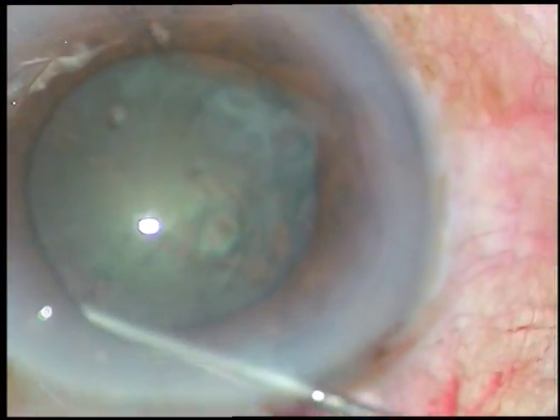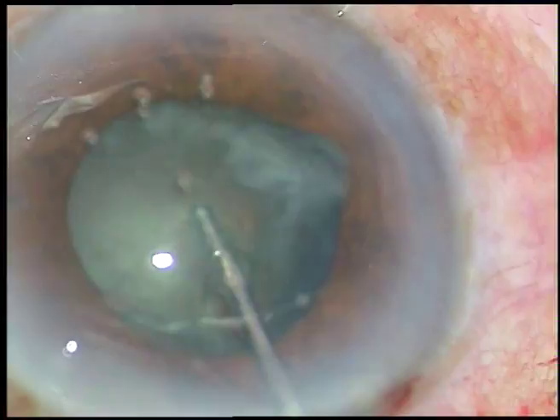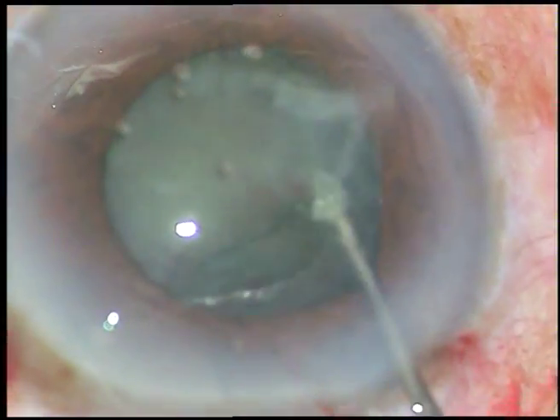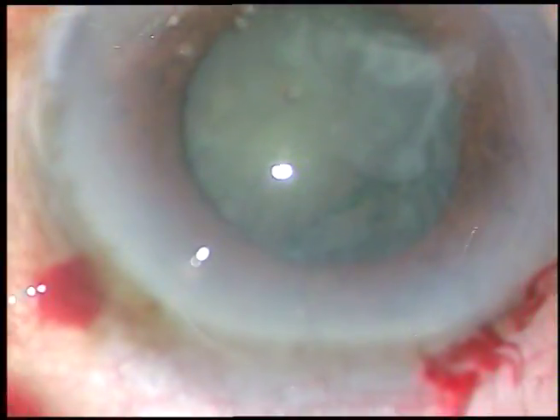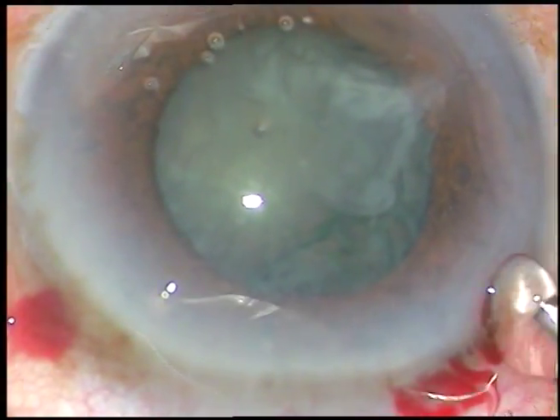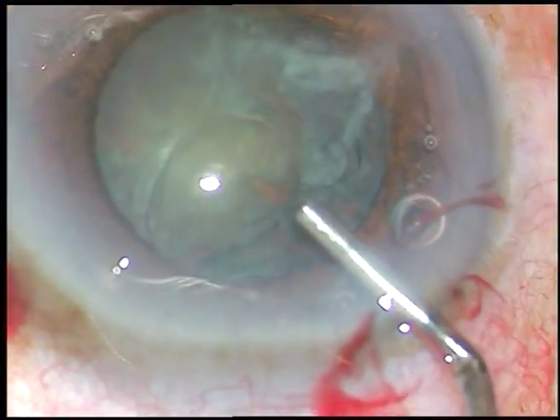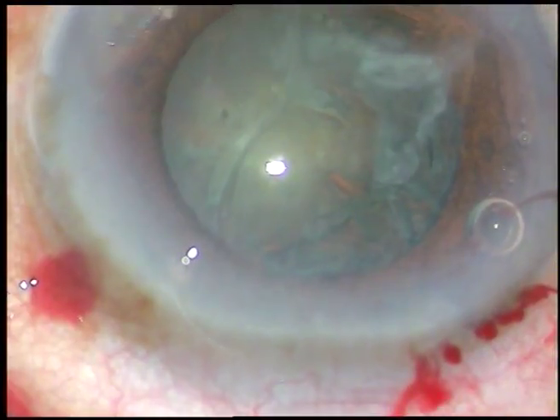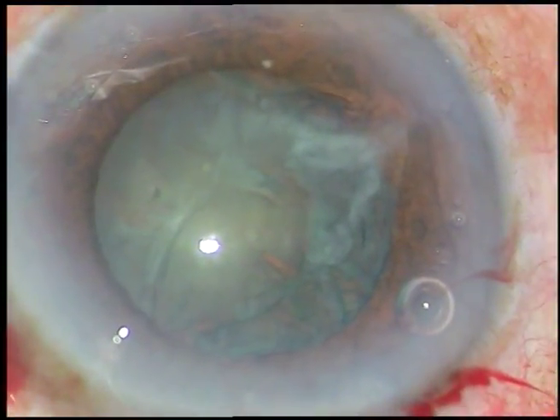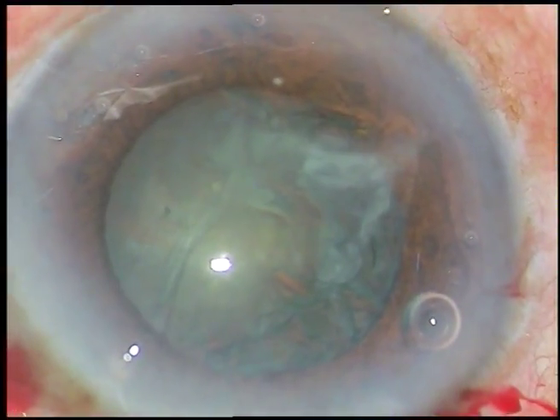Hydrodissection is done. Very gently we must depress the nucleus and rotate it. In this case the pupil has again become small — about 4.5 to 4 mm in size. When I start phaco emulsification of the nuclear fragments, it will decrease further as you will see in a very short time.